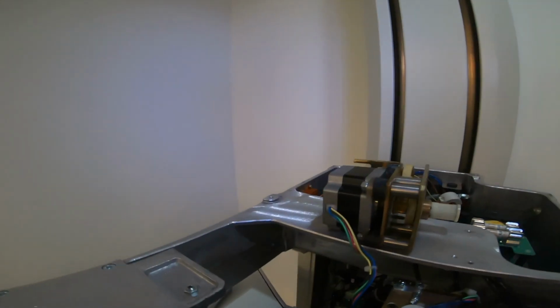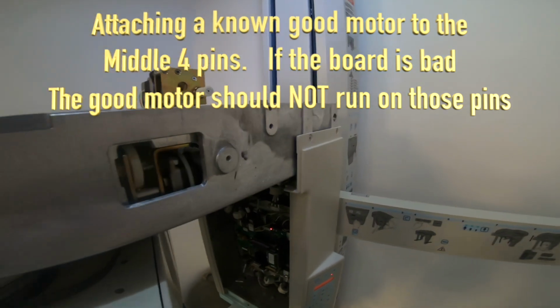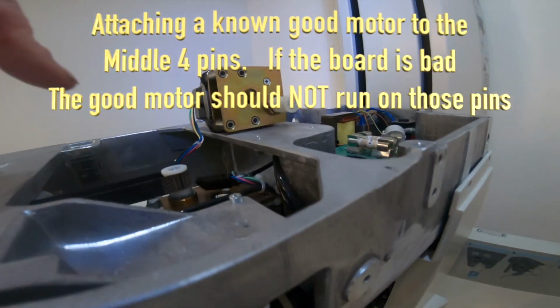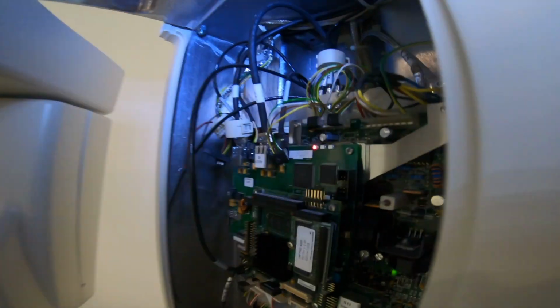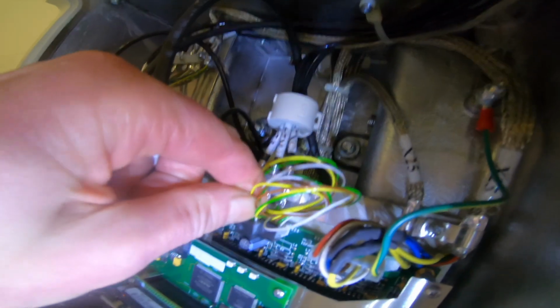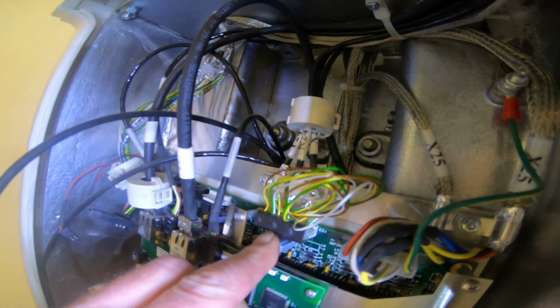Next thing I'm going to do is take the Y cable and put it onto the R pins. So I'm just swapping them. So here we go. We have the R cable on the Y pins, and now the Y cable is going on the R pins. So if the R pins are bad, or the circuit board is bad in the R area, this wouldn't work.